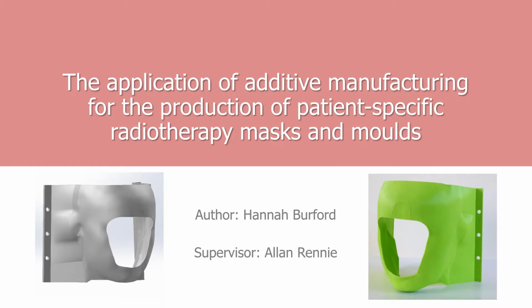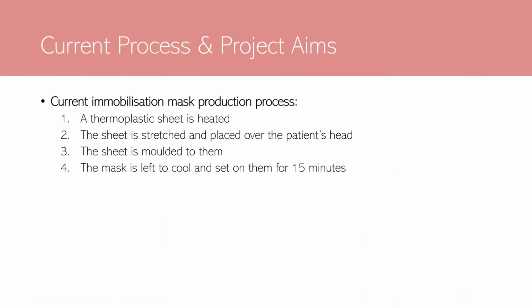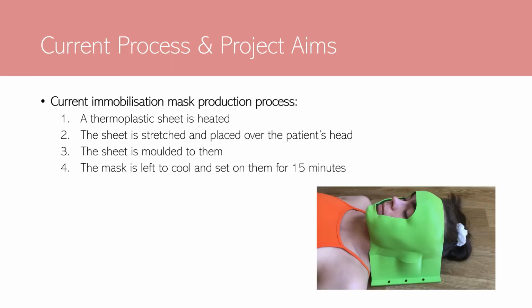The masks are used to restrict patient movement to within 2 mm in any direction. Traditionally, to produce a mask, a pre-cut thermoplastic sheet is heated in hot water before being placed onto the patient's face and then molded to fit. This is then left to cool on the patient for 15 minutes before being removed.